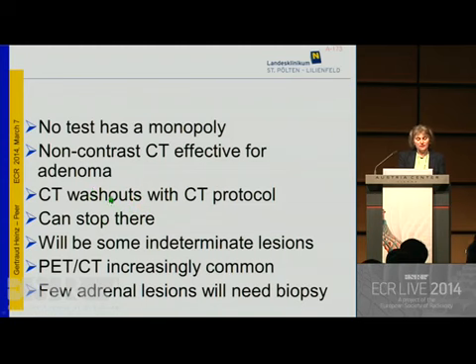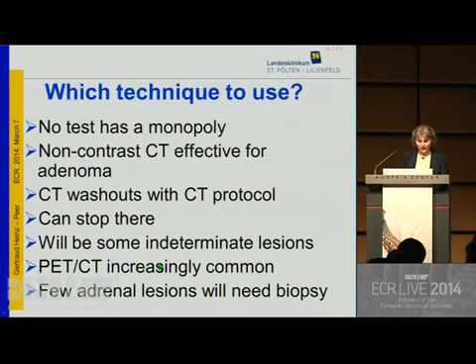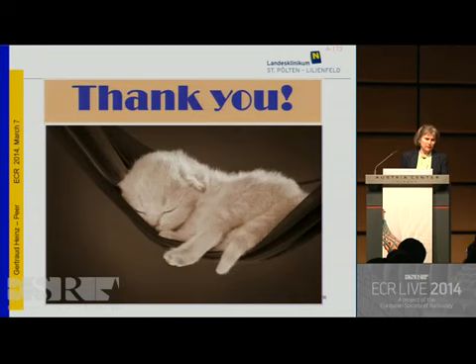And if these figures are clear, then you can stop here. However, despite modern imaging techniques, despite these washout calculations, there will probably remain a minority of lesions which will remain indeterminate. PET-CT can be of tremendous help, especially in patients with underlying cancers. However, a few adrenal lesions will still need biopsy. So thank you very much for your attention.